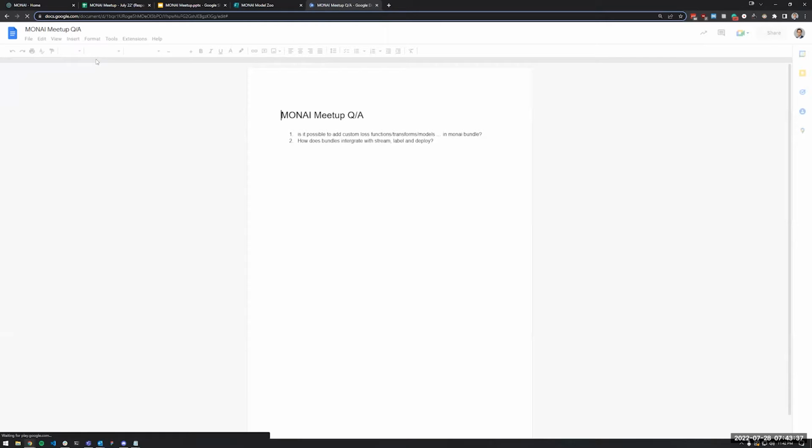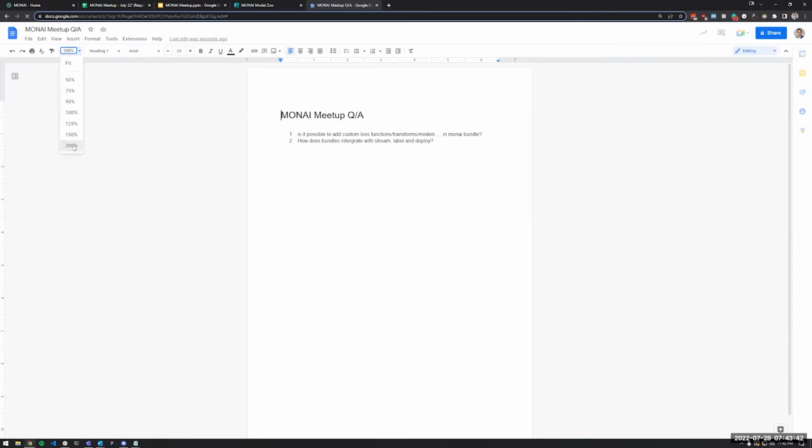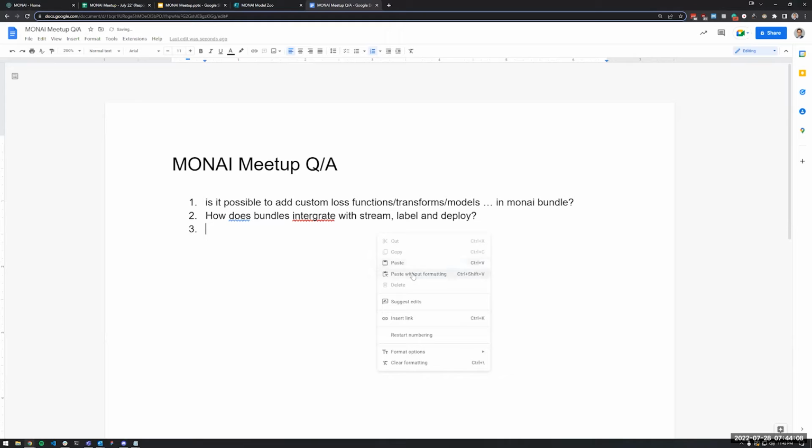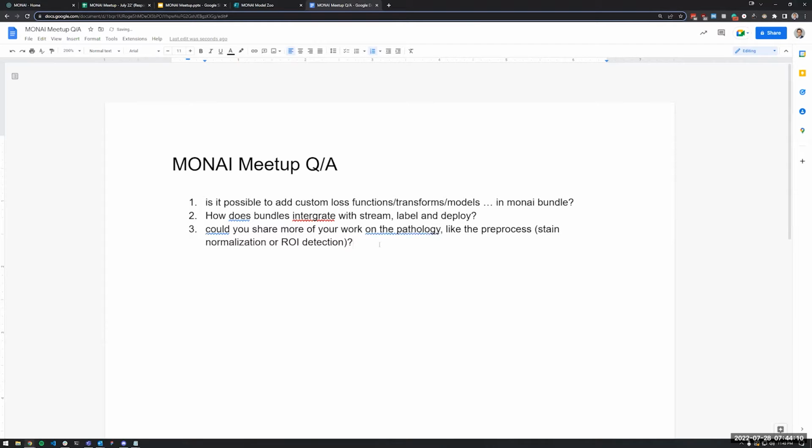In the past, you had to do things manually or adapt some existing code to get your network to work. But here, what we want to do is automatically generate an operator's internal structure from a bundle itself. So you should be able to automate a lot of the integration process to get your bundle into a Deploy context. We've approved that code just recently, and we have tutorials on how to use it, and we are now going to be destruction testing it to see how that works in practice. But I think we'll hear about that a bit later on.